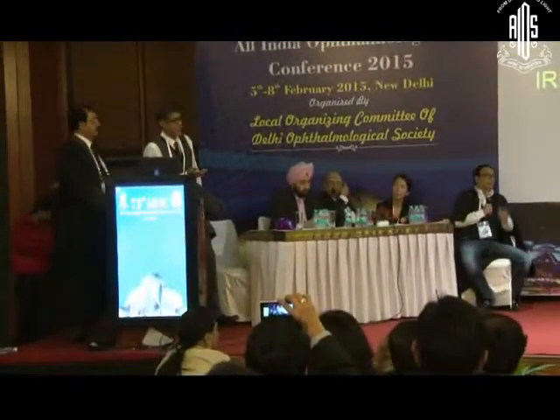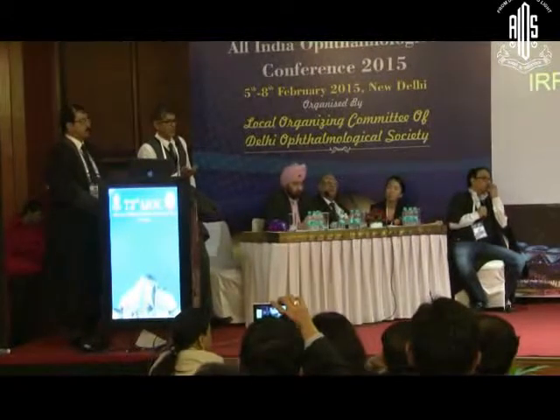You can always do a surface ablation or LASIK for 1.5. But this is more unsure. This is more unsure because with ICL, the main challenge is the biometry here. Even for a very high hyperopia, short axial length, you still have challenges there, and if you're putting a piggyback lens, then again even that has its own risk of complications.